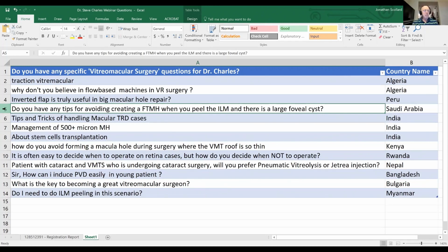And now we've changed gears dramatically, and we're talking about macular traction retinal detachment cases. I've developed scissor segmentation and delamination, and it's becoming a lost art, unfortunately. You cannot do safe, highly effective surgery for diabetic traction detachment cases without having the capability of using curved scissors delamination. The vitreous cutters with better fluidics, with the beveled cutting tip, with higher cutting rates, certainly can do more than ever before.